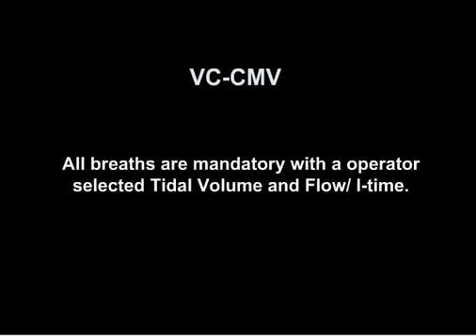First, VC-CMV. All breaths are mandatory with the operator selected tidal volume and flow rate or inspiratory time, depending on the ventilator.